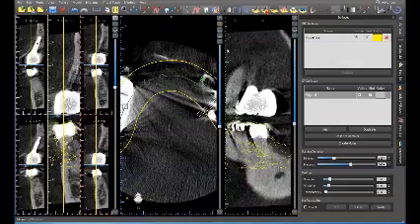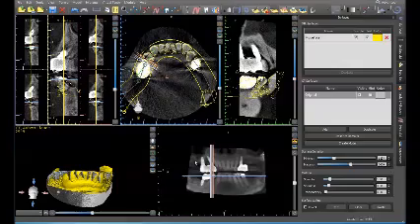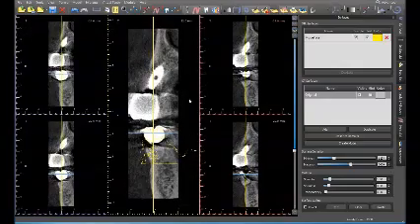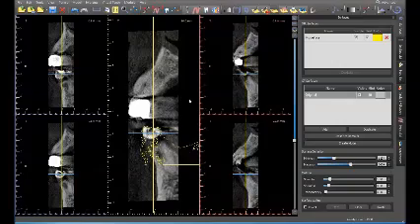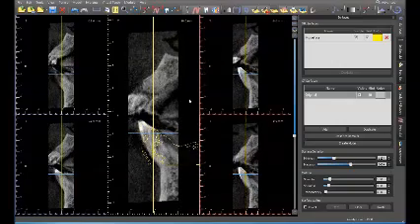And we're going to be placing an implant in this quadrant here. So we'll see how this comes out. That's the implant. It's within a good range. Yeah, it doesn't look bad at all.